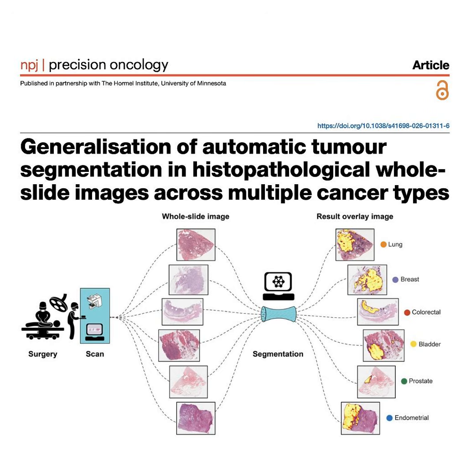Okay, so why did it fail so badly on the bladder? Does bladder cancer just look fundamentally different from everything else? Actually, it comes back to the exact vulnerability you pointed out earlier with the hysteresis thresholding. The erasing of faint signals. Exactly. The biological appearance wasn't the main issue. The physical state of the tissue was. These specific bladder samples were collected through a procedure called a transurethral resection, or TUR.